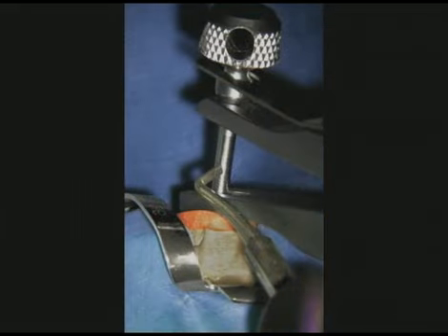This photograph shows the extracting plier mounted onto the engaged tap, the compressed rubber cushion protecting the tooth from the removal forces, and a previous version of the Endo 1 vibrating the engaged tap.